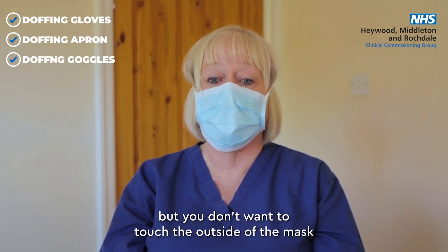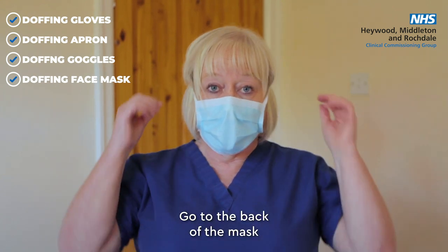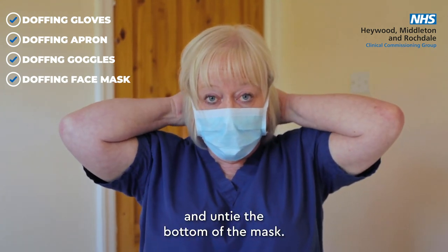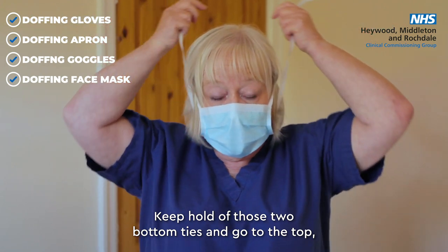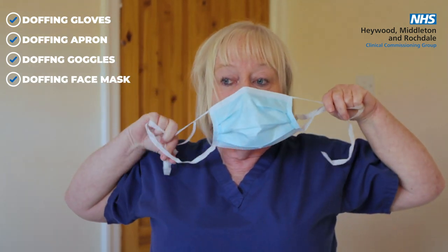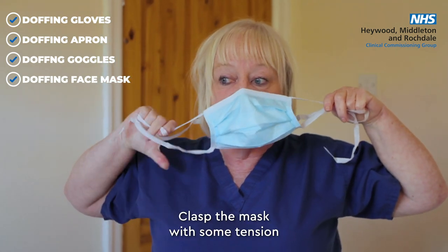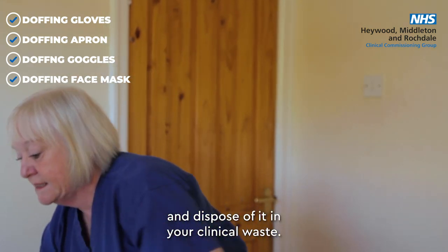Your hands are clean, but don't touch the outside of the mask because that is contaminated. Go to the back of the mask and untie the bottom strings. Keep hold of those two bottom ties and go to the top and undo the top strings, holding all the ties. Then grasp the mask with some tension and dispose of it in your clinical waste.